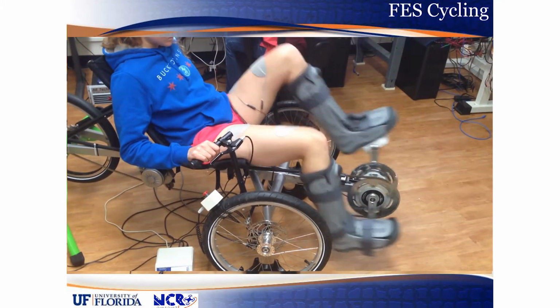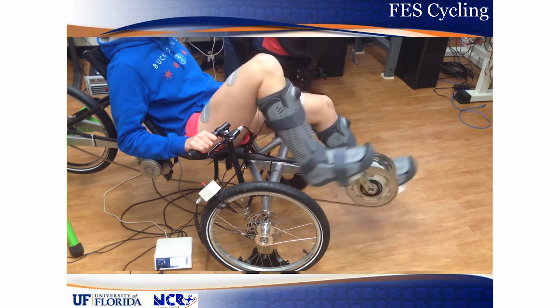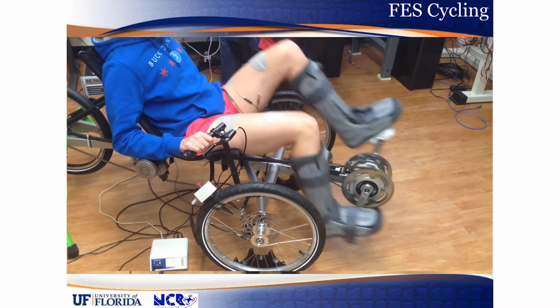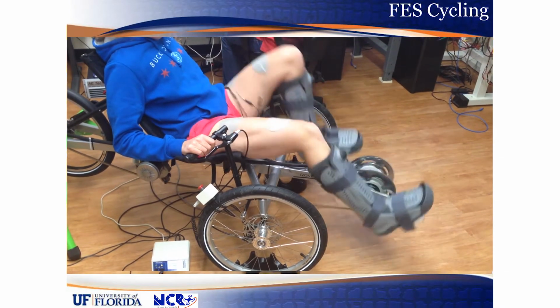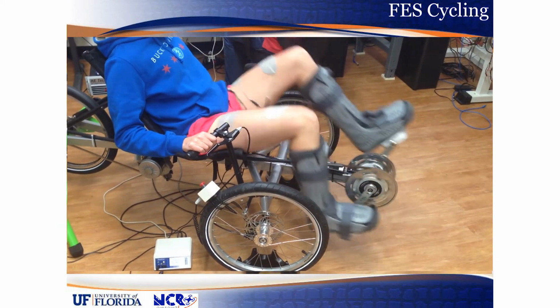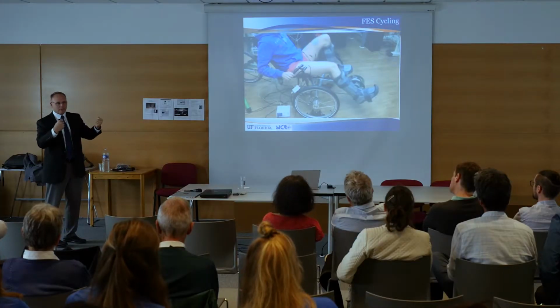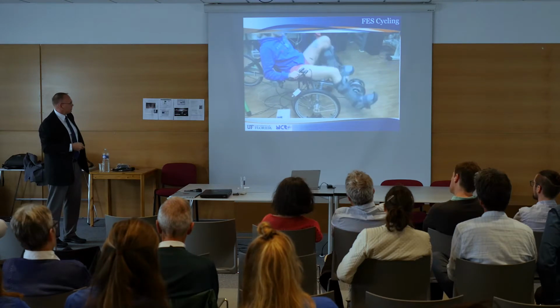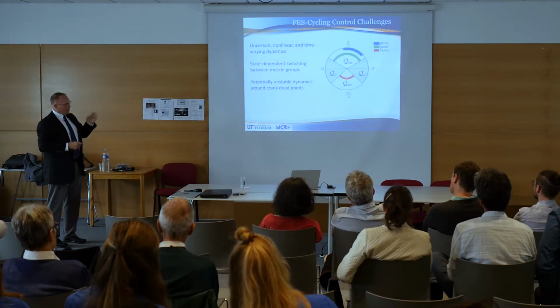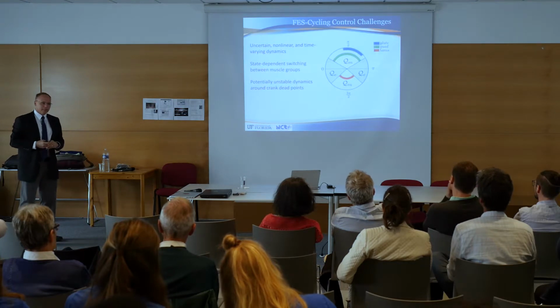This is one of our cycles here. This is our split crank cycle. You can see there are 2 cranks. Right now it's set up in a normal configuration, so you only see 1 chain there. But we have it set up so that you can mechanically decouple the left leg and right leg in order to do different tests.